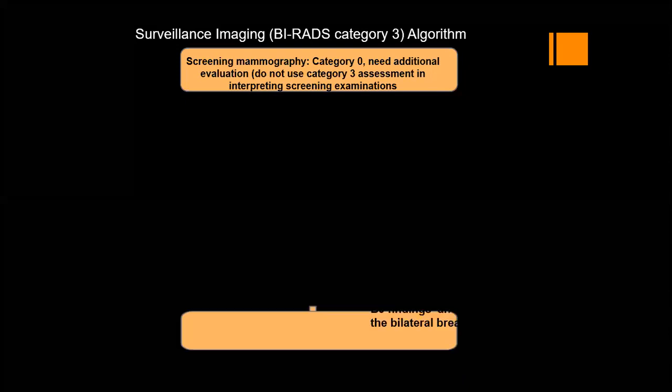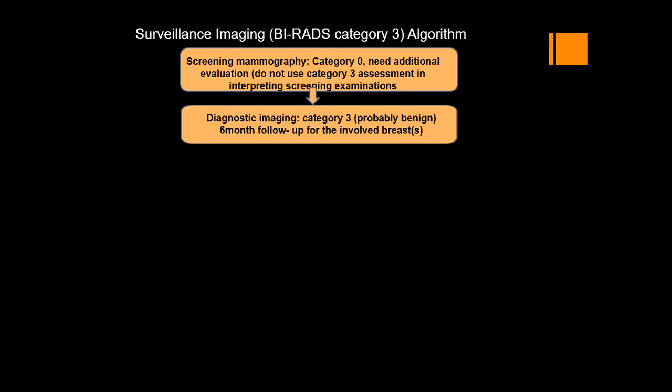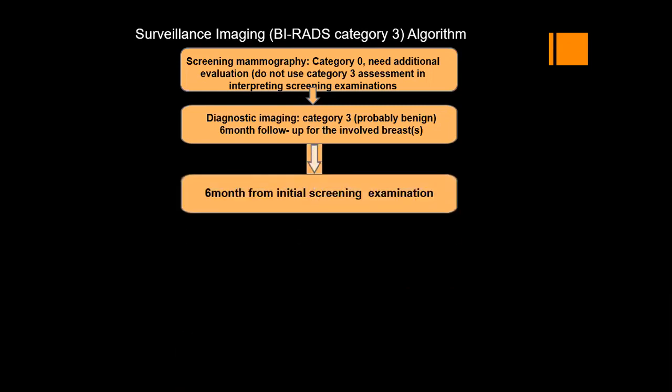After diagnostic workup reported as probably benign, we will give a 6 month follow-up for the same breast, 6 months from the initial screening mammogram being evaluated.